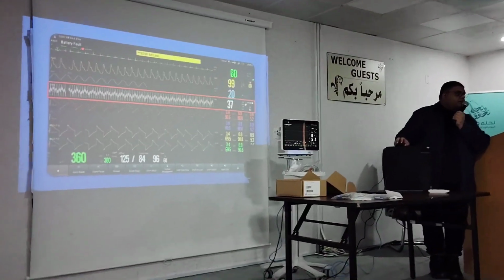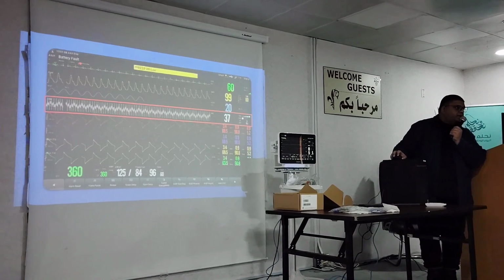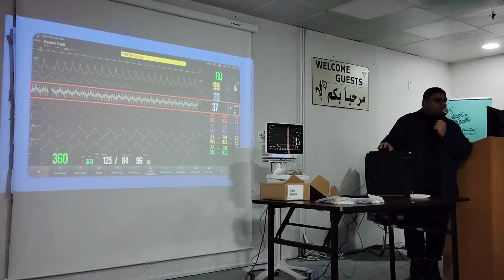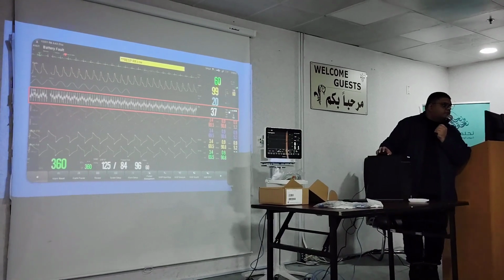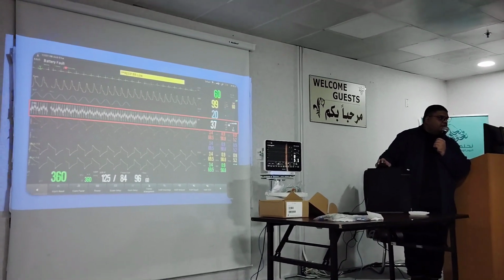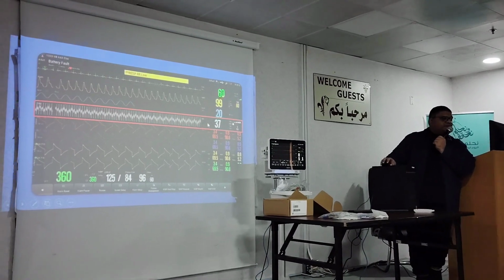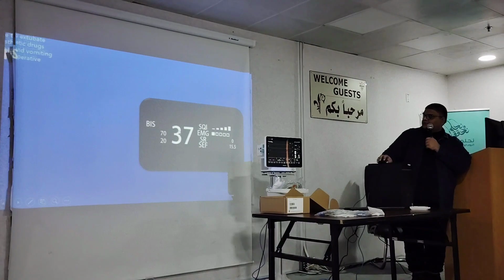Okay, let me tell you. If the index is 100, that means the patient is awake, fully alert, conscious. 100 or close to 100. And 40 to 60 is the normal range, where the patient is under adequate anesthesia. Below 40, you would say too much anesthesia, so decrease the dosage. So this is a little bit too much, but it's around the normal range. So this is what it looks like.